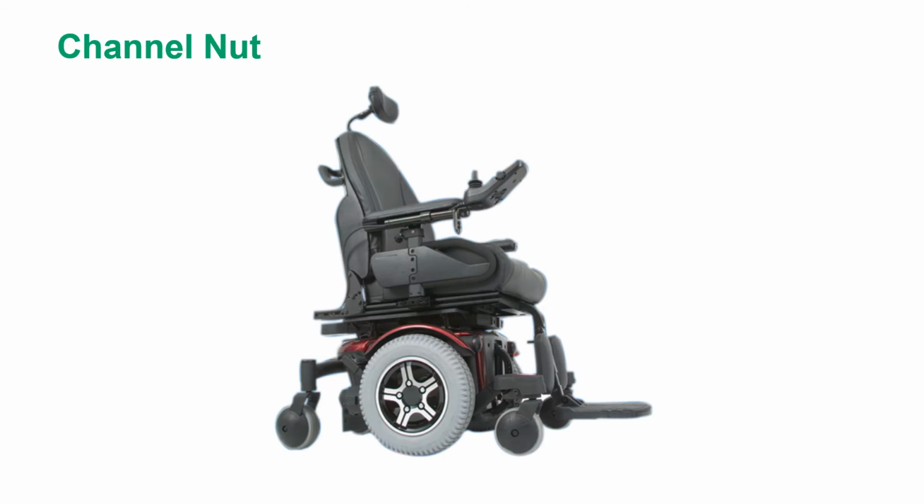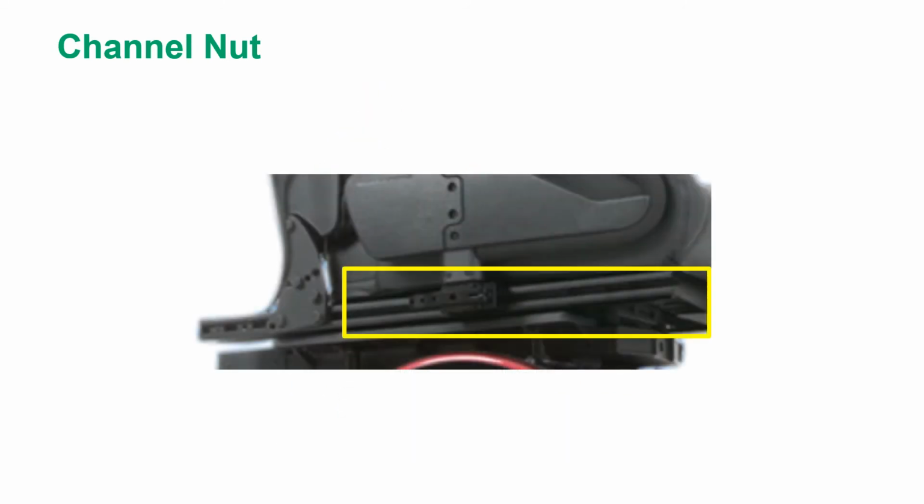The channel nut inner piece is designed for use on chairs with a single grooved track system. Some models of chairs that feature this single track system include the Quickie S636, Jive M2, and models from companies such as Quantum and Invacare. Here is a picture of a standard track system where a frame clamp would fit. Notice the single groove. As always, there are some situations where a different clamp may be needed, as in the case where there is no room due to wheelchair restraints or other items blocking the use of the track.